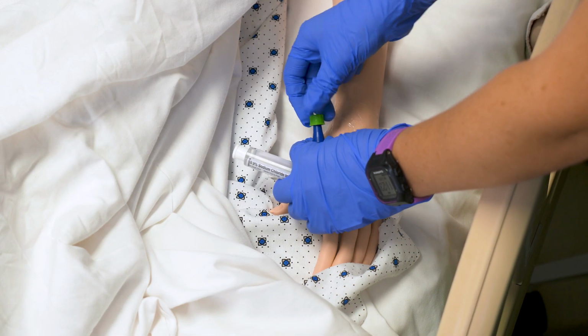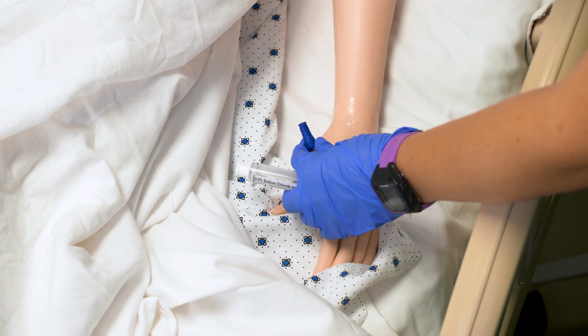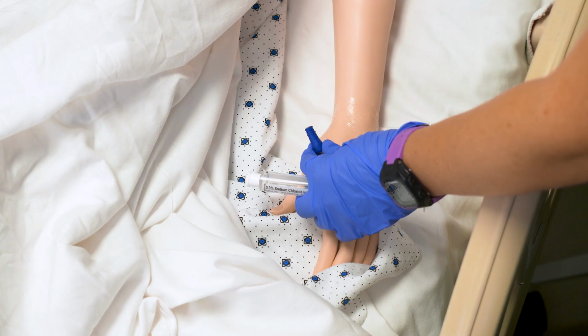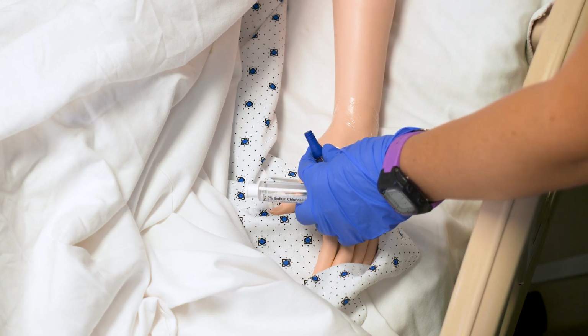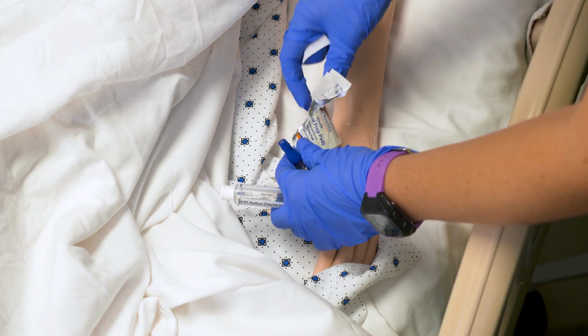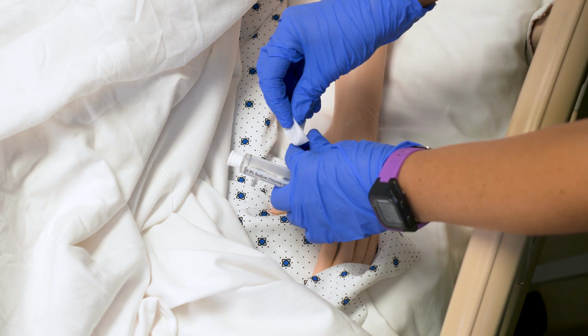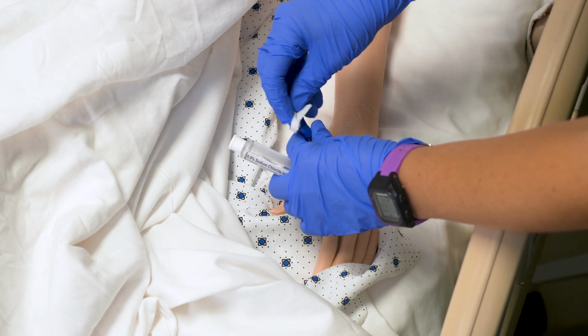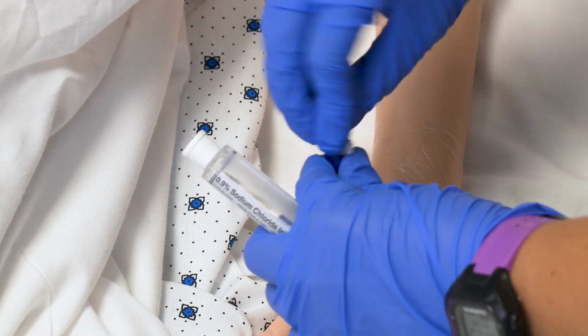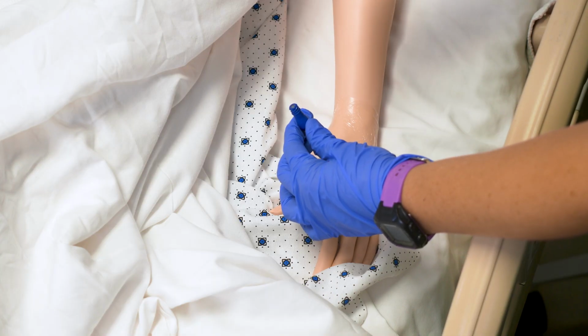So I'm going to go ahead and remove my Curos caps. These are one-time use only. It is recommended that you scrub your hub or your injection port for at least 15 seconds and then allow it to dry. Once I clean the injection port, I do not want to touch it.